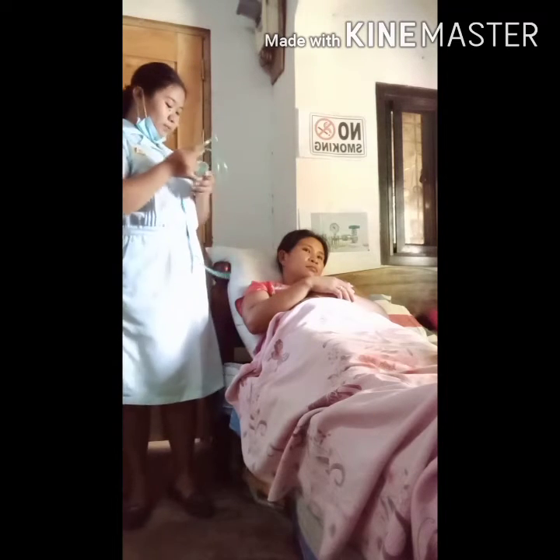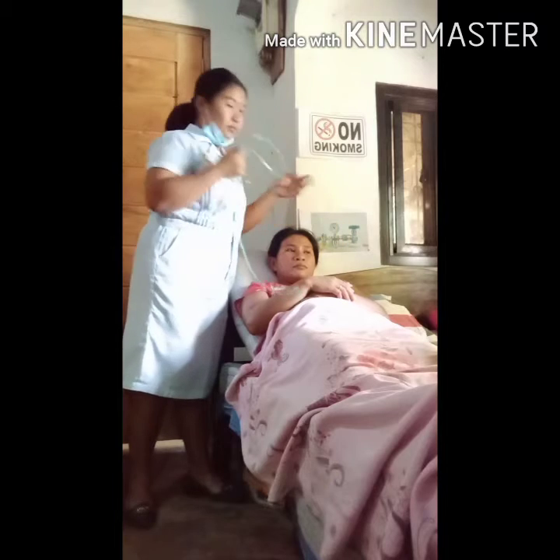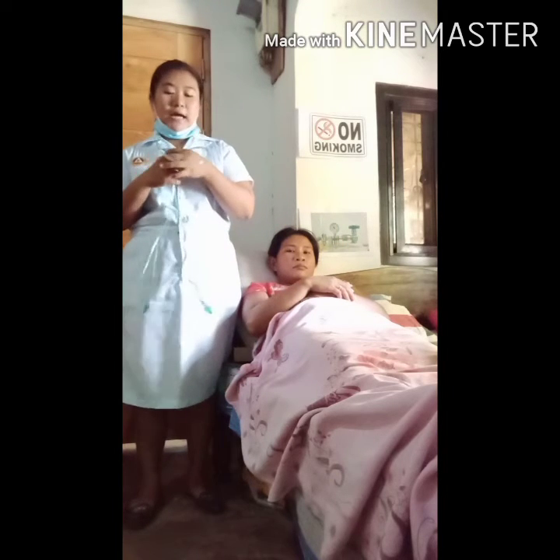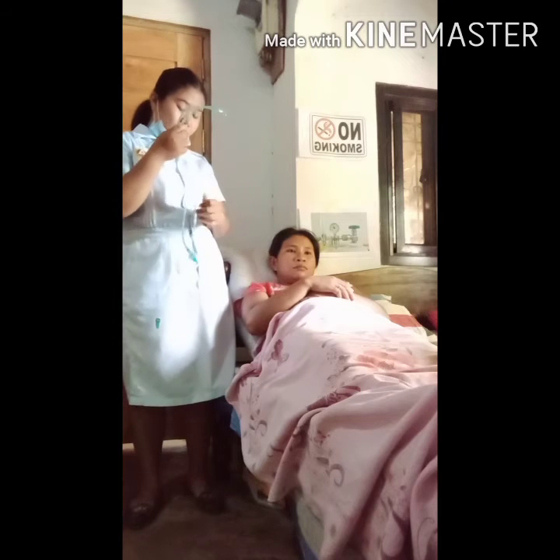So, next is for the nasal cannula. Insert the flow meter into the wall outlet or oxygen tank. And then attach the oxygen tubing to the nozzle on the flow meter.